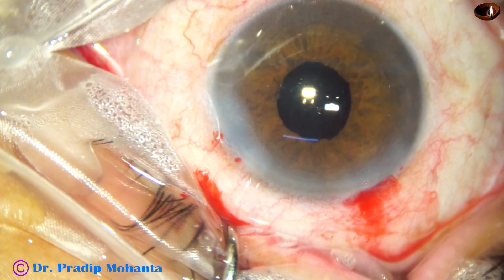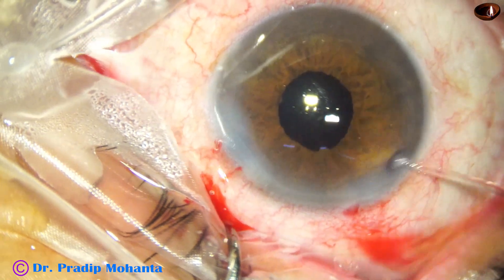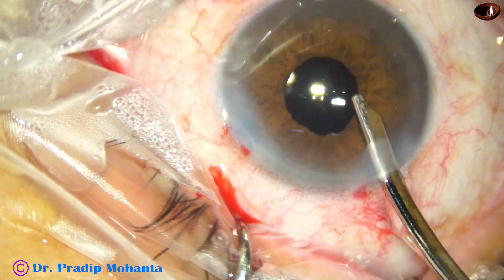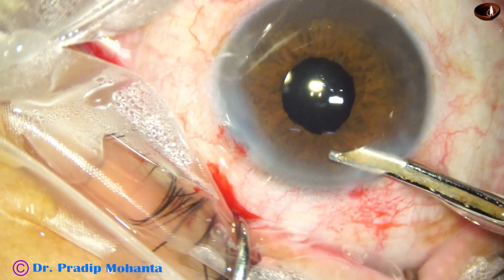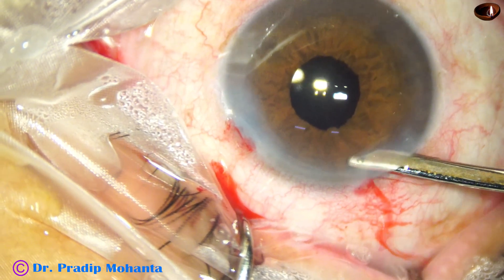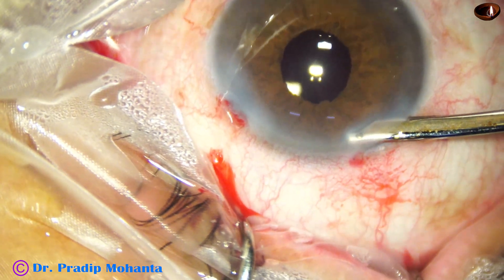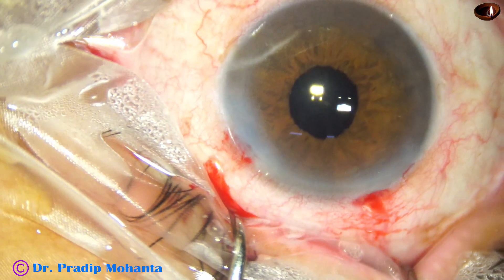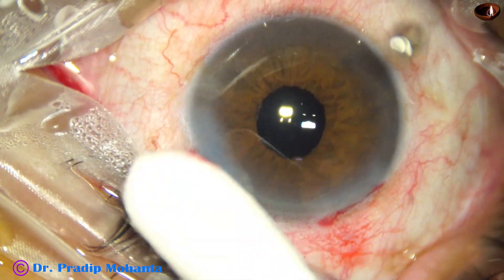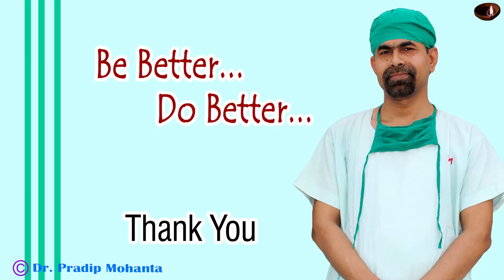This is closure of the side port. Finally, the anterior chamber is nicely formed, integrity of the wounds is checked, and a few drops of moxifloxacin are applied over the ocular surface. The case is concluded.